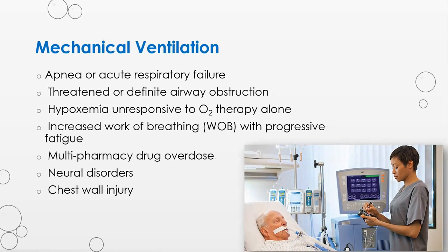I am going to begin to talk about mechanical ventilation with invasive mechanical ventilation. Here are just some of the reasons why invasive mechanical ventilation will be initiated. It all has to do with compromises to ventilation and the need to improve gas exchange.